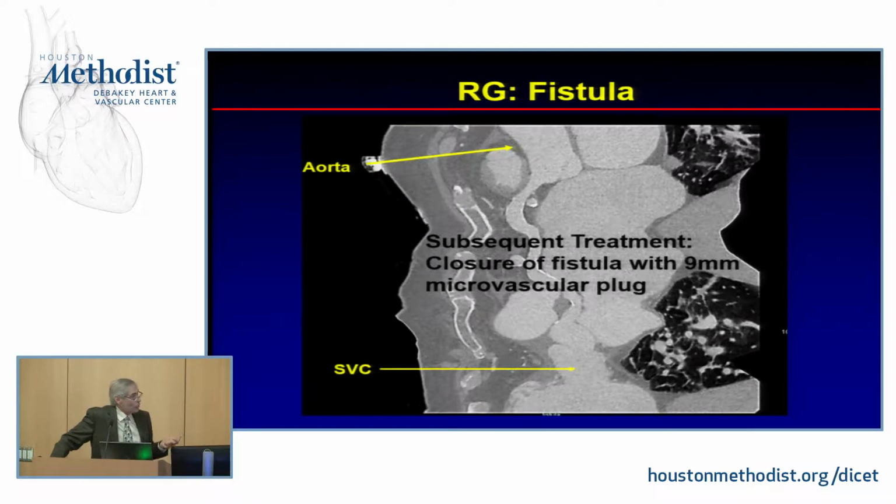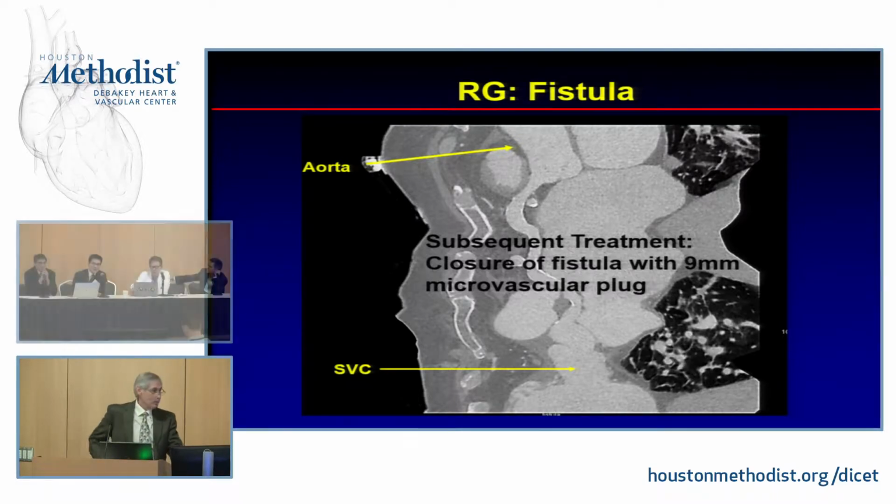And the CT was done really as from, obviously more from an anatomic point of view to get a feeling for where things were. But actually, we see these not infrequently. We have several case examples. Some go into the coronary sinus from either the left side or the right side. Some go into the right atrium directly rather than just into the SVC. But it is an interesting case, and it is a nice case of left to right shunting off the coronary artery. So there's a cautionary tale to this.